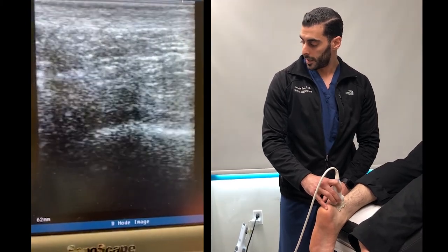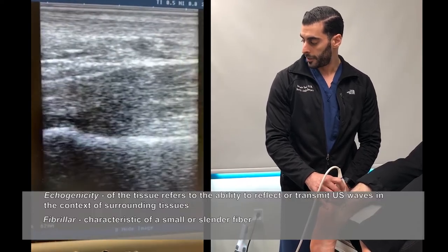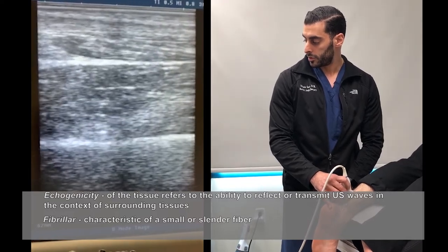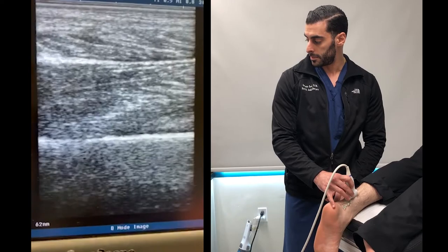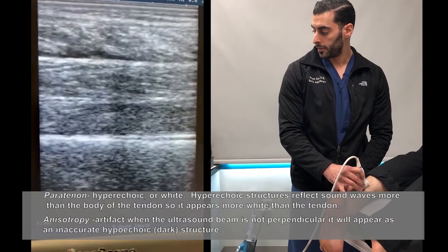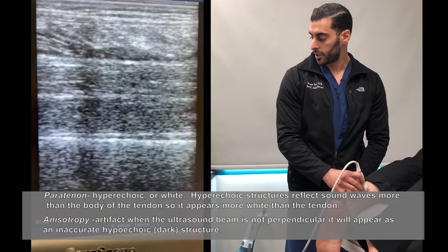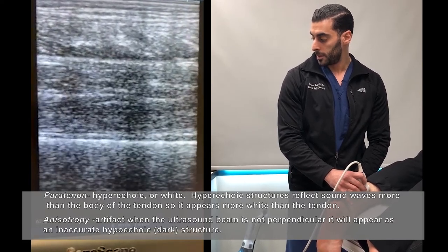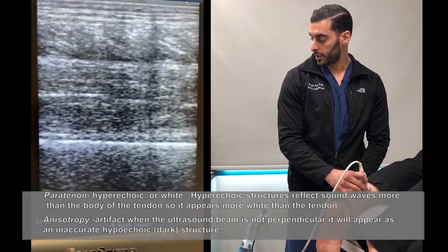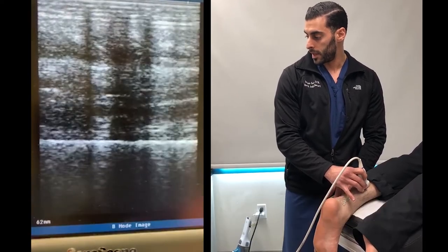You're going to see that the tendon normally appears echogenic and fibrillar, with a thin echogenic layer of surrounding connective tissue. You will be able to see the peritenon, which envelopes the tendon. You want to be careful of the principle of anisotropy — it must be taken into consideration when imaging the Achilles tendon, because anisotropy will give you a false impression of tendinopathy due to the hypoechoic image that results.